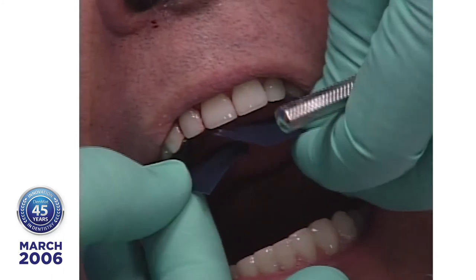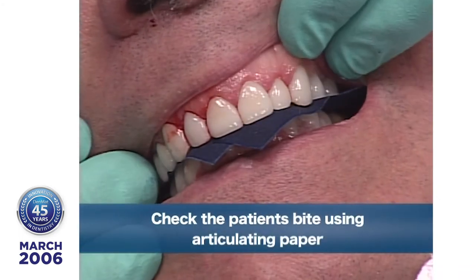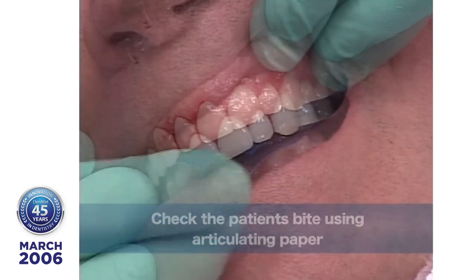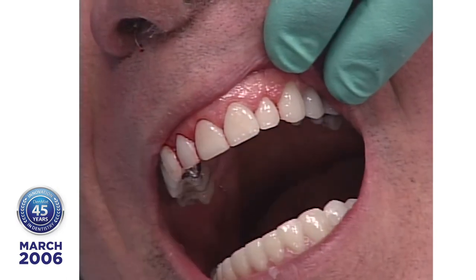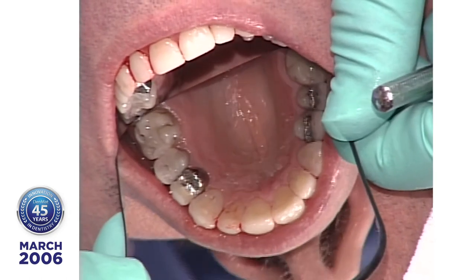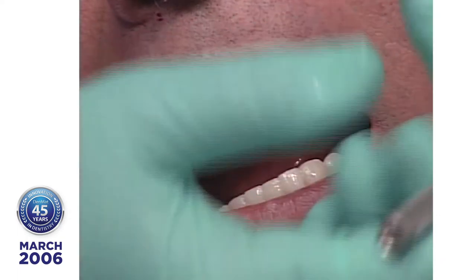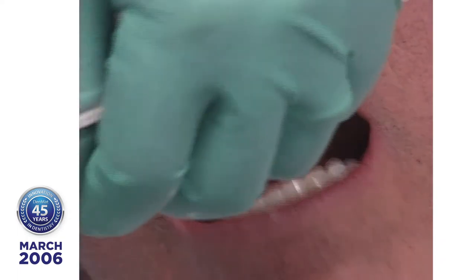But let's have a little marking paper. Now gently close your teeth together. And that kind of gives you some idea of what we've achieved already, and we're not finished. Let's take a look at the lingual here. And you can see we don't have very much Ultrabond on there. It's almost all cleaned up.